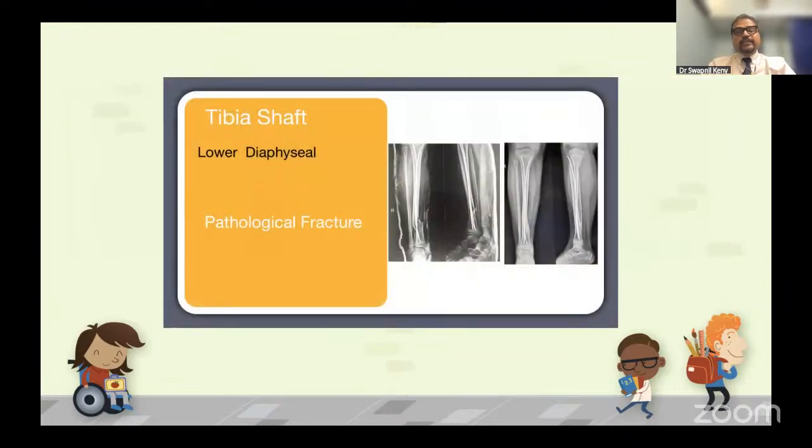You can also use it for pathological fractures. Like this was a fracture through a cyst. And whenever there is a pathological fracture, and if you tend to put an intramedullary implant across a pathological fracture, many a times the cyst heals naturally. So what this nail actually does is that it irritates the lining of the cyst, the simple bone cyst or a unicameral bone cyst as it is called. So it irritates the lining of the cyst wall, causing early healing and new bone formation, which is very, very clearly seen in the X-ray.